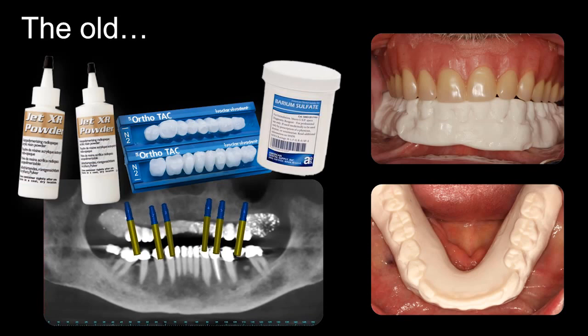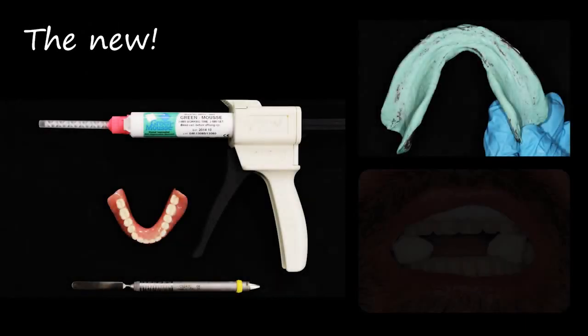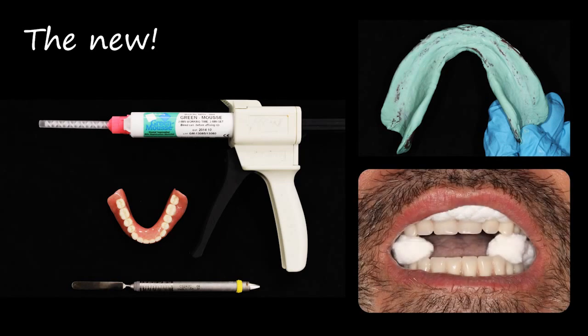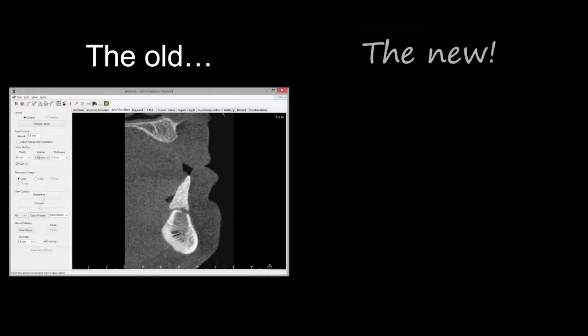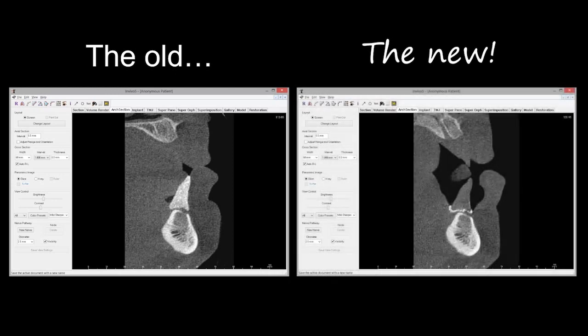Most scan imaging centers prefer not to use radio-opaque acrylic materials or barium sulfate anymore — it creates a lot of scatter on the radiograph. The newer approach is to use a radio-opaque PVS impression material on the inside of a patient's denture. We essentially reline the patient's denture using this PVS impression material and do a CBCT scan of the patient wearing it. We still accomplish the same clinical goals of visually seeing the restorative plan in the CBCT scanning software, just as with the barium sulfate guide versus the denture with radio-opaque PVS — both images give a very similar appearance.